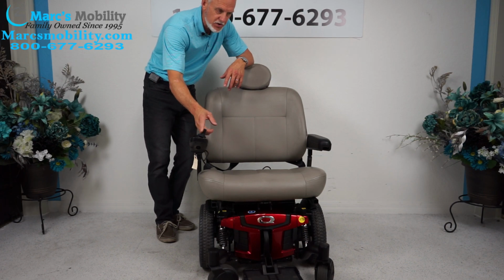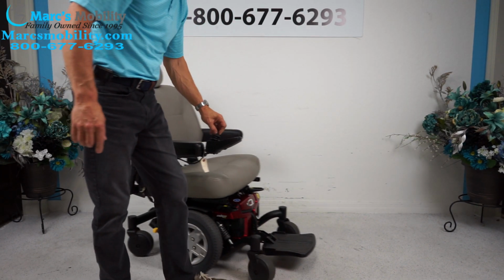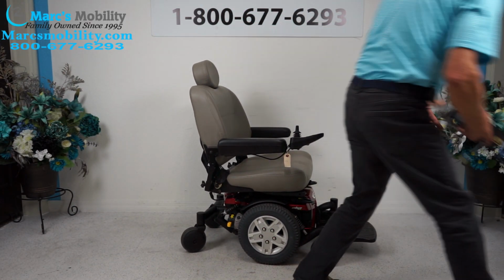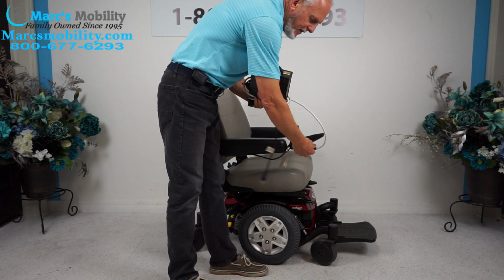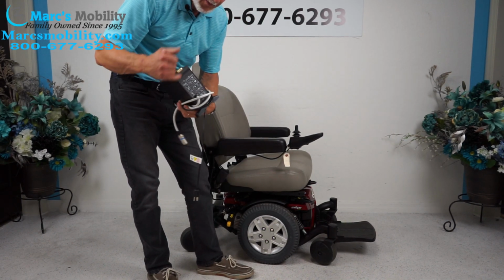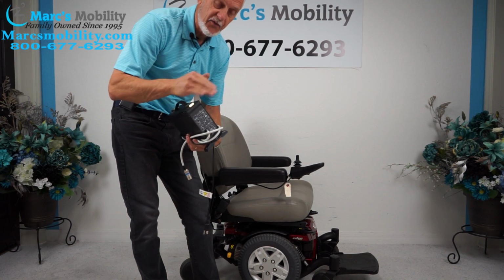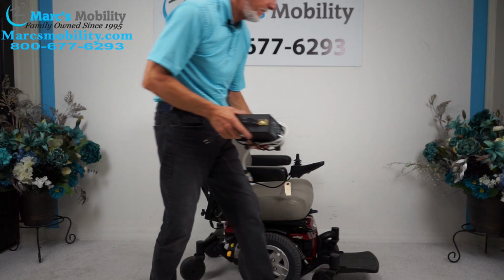Now when you charge this chair, you'll take your Quantum charger. Let me bring it back over here. You'll take your Quantum charger and you'll plug it right below the joystick. Like most power chairs, this is where you would plug it in. And as soon as the light goes from orange, which is charging, and it turns to green, that means it's full. The charger will recognize it and it'll stop charging.